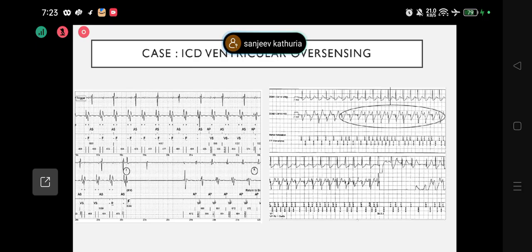Students, dear friends, say yes or no, say something. Okay, so it is counting as one R wave, as nicely explained. One beat as per the detection is the R wave. The second beat is the T wave. So if, let's say, the rate is 120, now it will be detecting 240, approximately. Some may be missed, but approximately it will be like that.